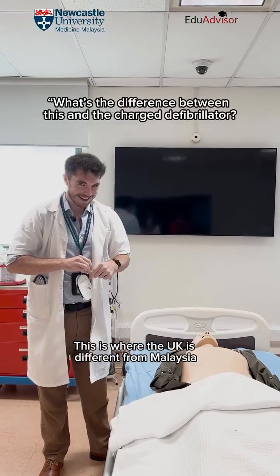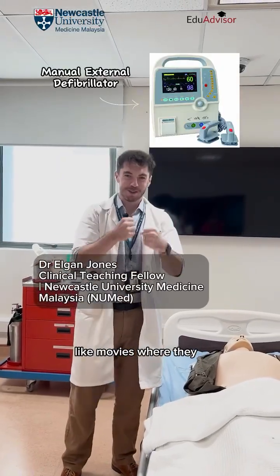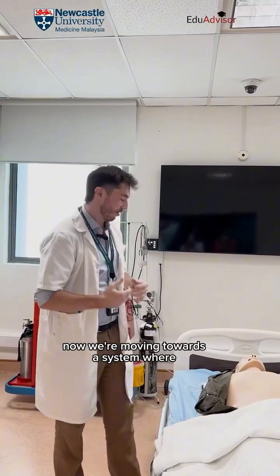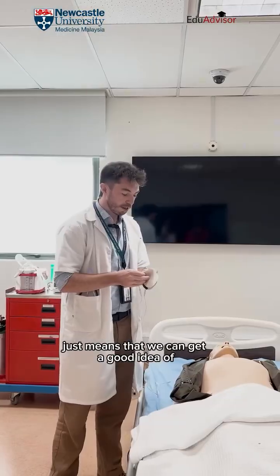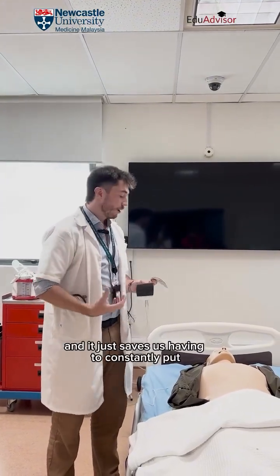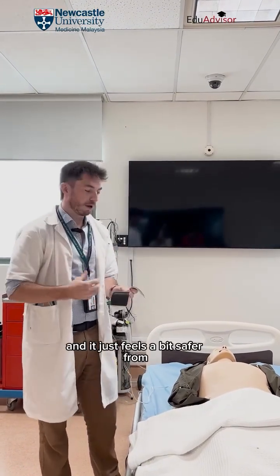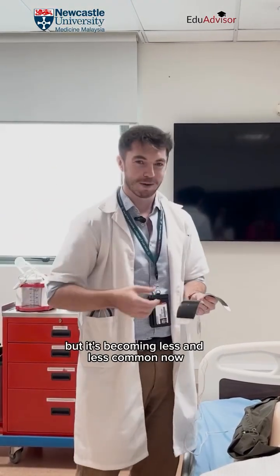This is where the UK is different from Malaysia. You may have seen in movies where they charge the paddles up — unfortunately that's not too common now. We're moving towards a system where we have sticky pads that go on someone's chest. It means we can get a good idea of the rhythm the heart is in when it stops, to see if we can deliver a shock. It feels safer from a delivery standpoint, though there are still some times where we use paddles, but it's becoming less and less common.